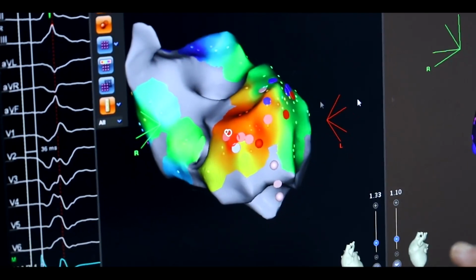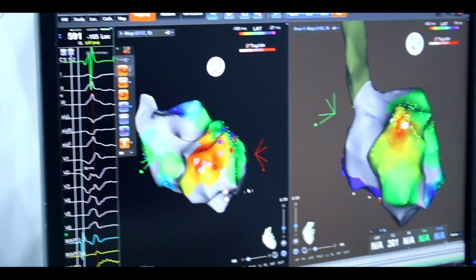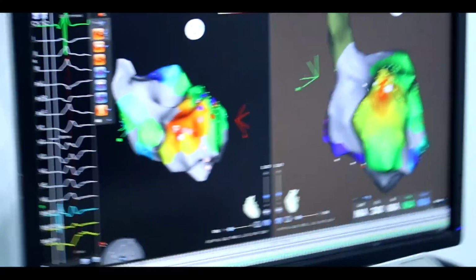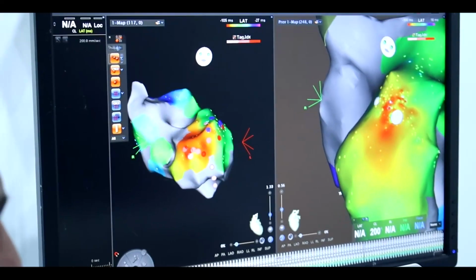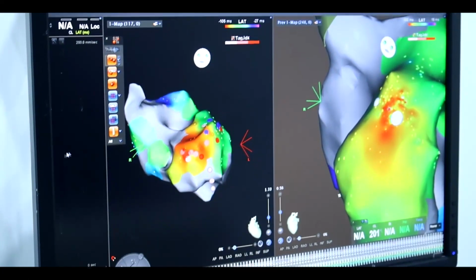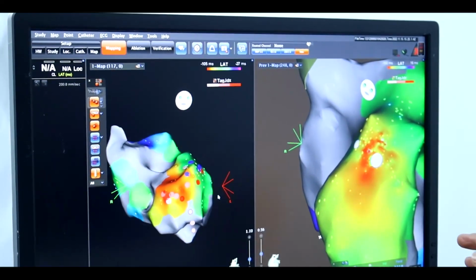This is today's study, and this is one month ago. Almost the same. Can you show the hot point here? You could show it or no? Signal? No. But this is the same.